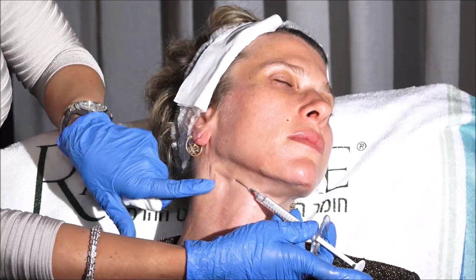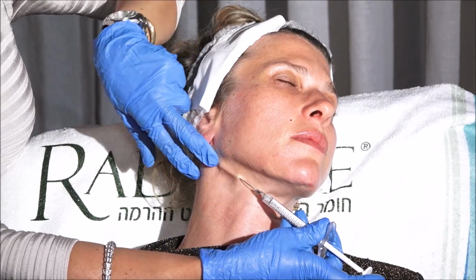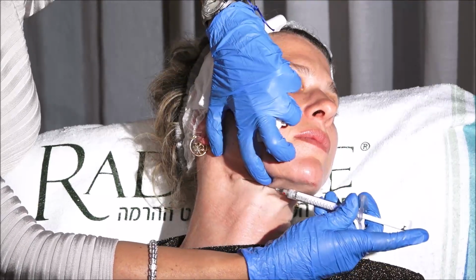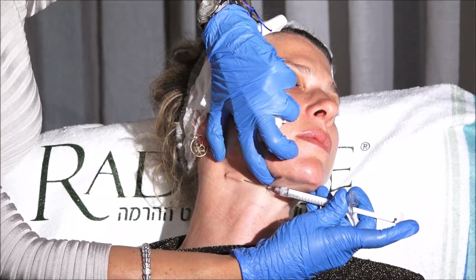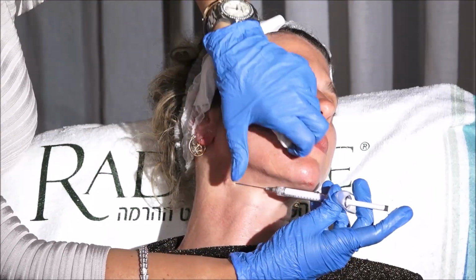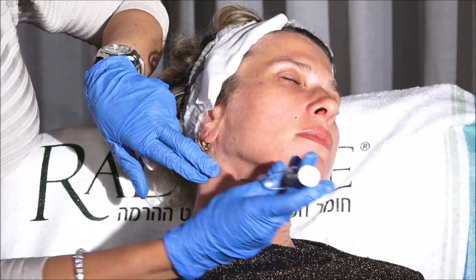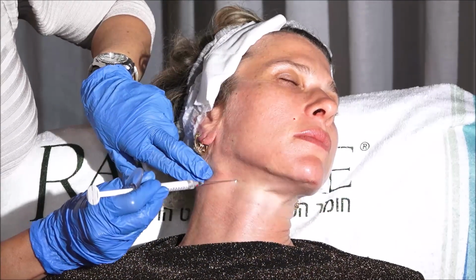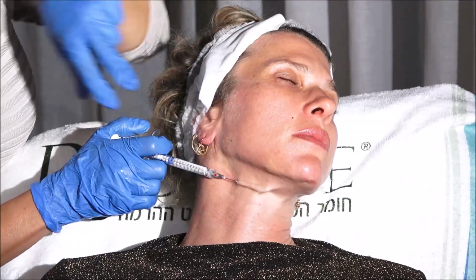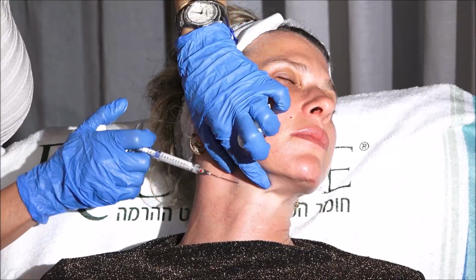Don't trespass the sternocleidomastoideus. You see that the sternocleidomastoideus is here. I'm going to give a small, tiny trace. Another one. Another one. Now I go frontal. Cross to the other border, to the other side.